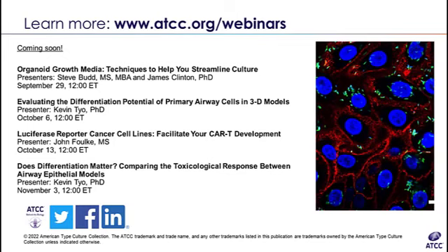So, the first thing that would immediately come to mind about vials from the same freeze down that aren't growing well is, is it being handled by the same researcher? Are the reagents the same? Is the media the same? Are the protocols the same? Things like that. That would be the first thing that I would immediately want to look into.